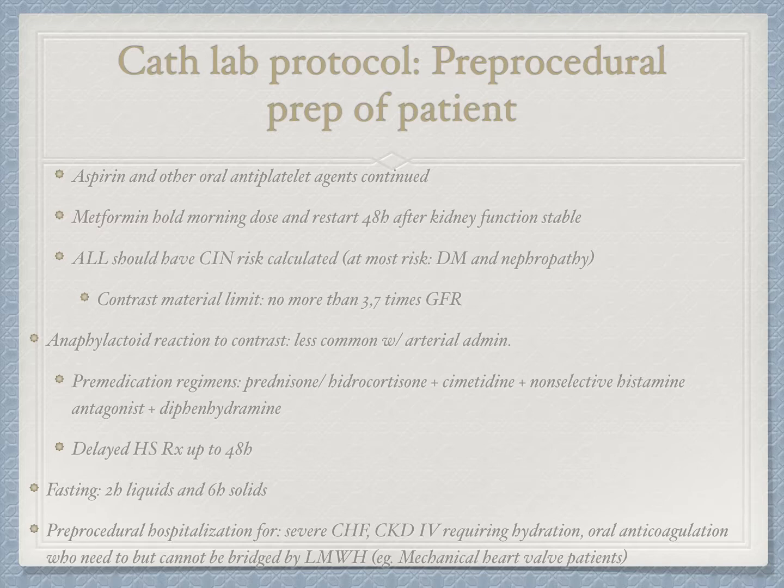Anaphylactoid reaction to contrast is less common with arterial administration, and pre-medication includes prednisone or hydrocortisone, cimetidine, a non-selective histamine antagonist, and diphenhydramine. Fasting should be 2 hours for liquids and 6 hours for solids. And pre-procedural hospitalization is for patients with severe CHF, stage 4 kidney disease, or oral anticoagulation that needs bridging.